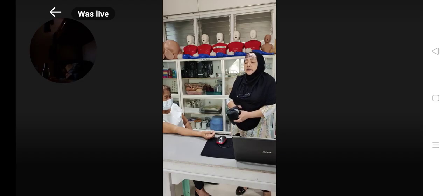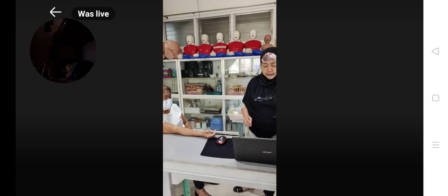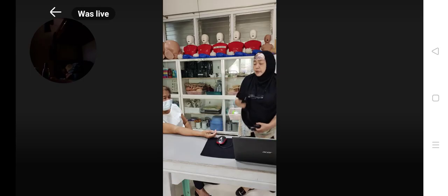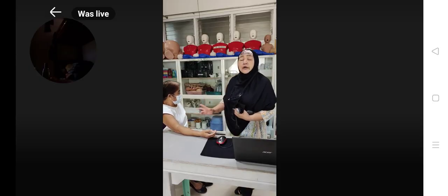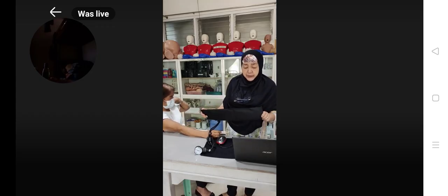Okay? Position your patient. Now I am positioning my patient in a sitting position, but if the patient cannot sit, he or she will just stay in the bed. Otherwise, if it's specified, your patient will only be on the bed. Okay? So, moving to the client, you move the client's shirt from the upper aspect of the arm of your patient. This is the correct way of taking your blood pressure.